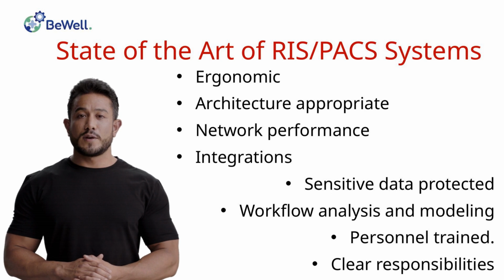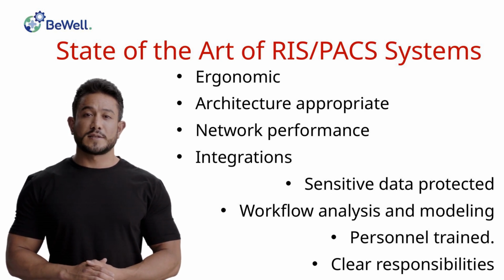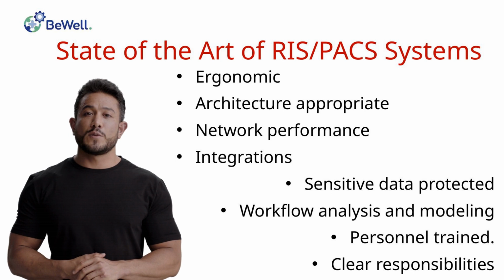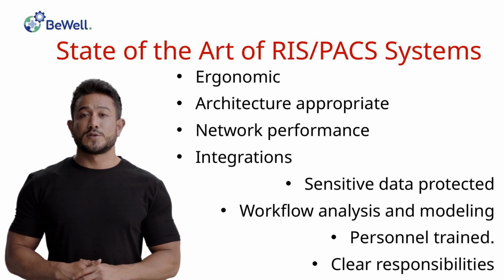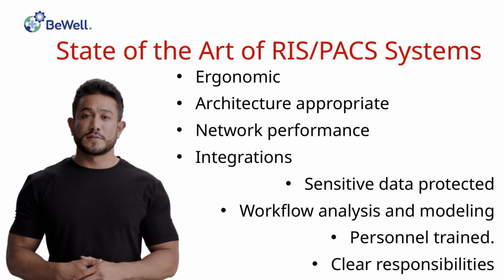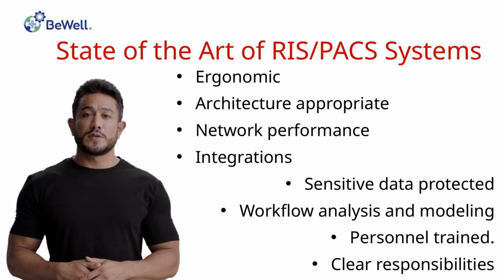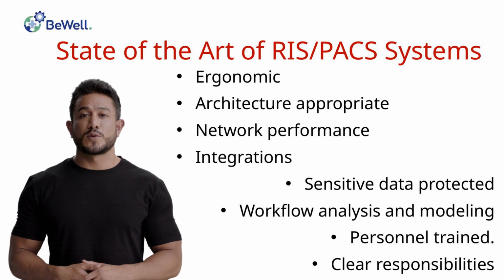It is of fundamental importance to highlight the significant features of a RIS PACS system. From a technical standpoint, it is necessary to ensure that client workstations are adequately ergonomic. The architecture of the client structure is appropriate for the site of interest. Network performance supports data traffic without causing transmission delays. Integrations with enterprise systems are properly analyzed.